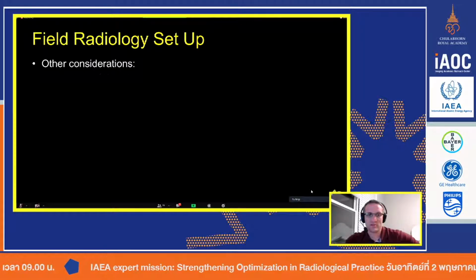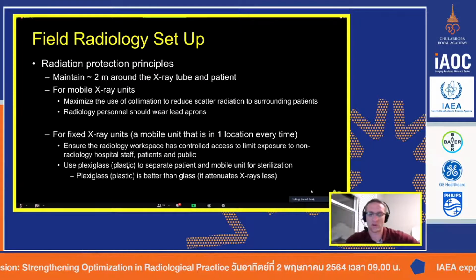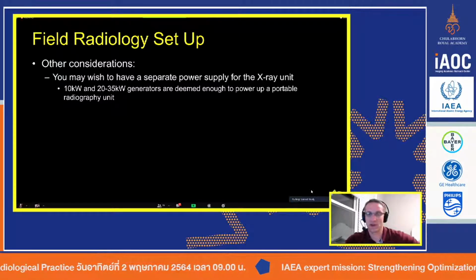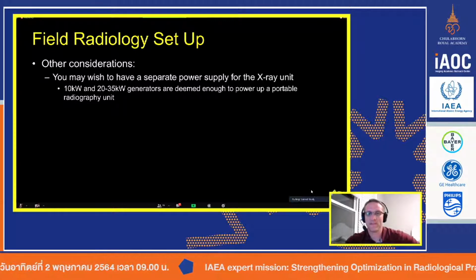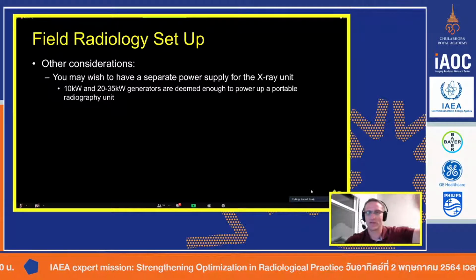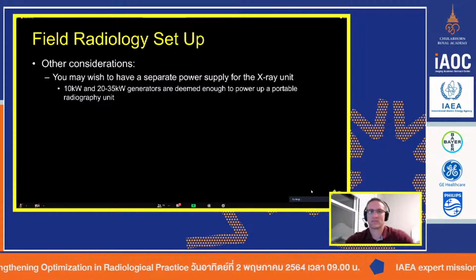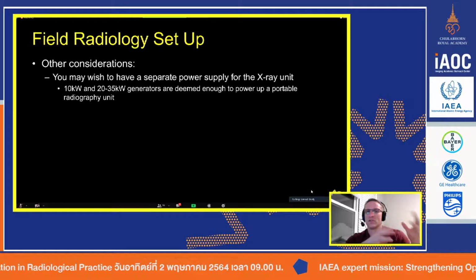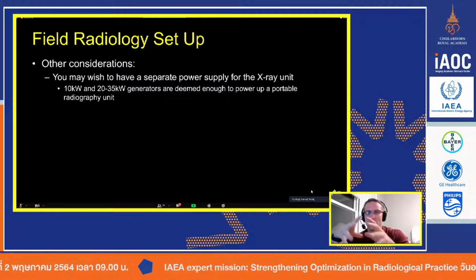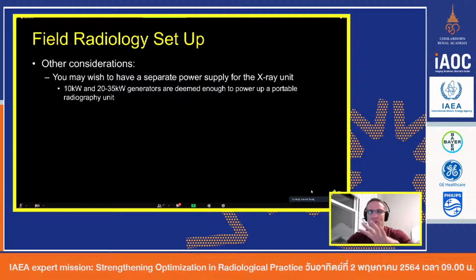Okay, let's go back to my slide. There we go. So image through plastic if you're setting it up where you will be able to control your imaging environment. You may need to make sure you have a separate power supply for your portable. As people are coming and going, they have the overhead lights, they have all of the equipment, ventilators, whatever's going on in there. That might be a very taxing environment on the power supply. So it might be intermittent. It might have spikes and peaks and valleys. So if you could set up your own power supply, the portable scanner will actually perform better having its batteries fully charged and being able to consistently image.